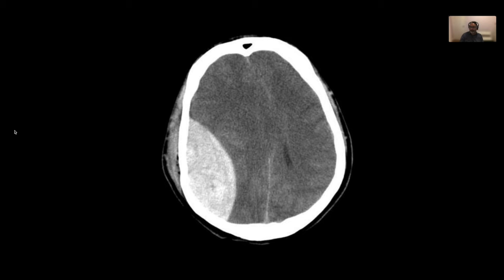Okay, now these are hemorrhages. These are very important. You have to know these. So that's a hemorrhage, but there are four types of hemorrhages. There is an extradural hemorrhage. There's a subdural hemorrhage. There's a subarachnoid hemorrhage. And there is an intracerebral bleed. And I will show you the differences, but again, this is your turn. Have a guess. What sort of hemorrhage is it?